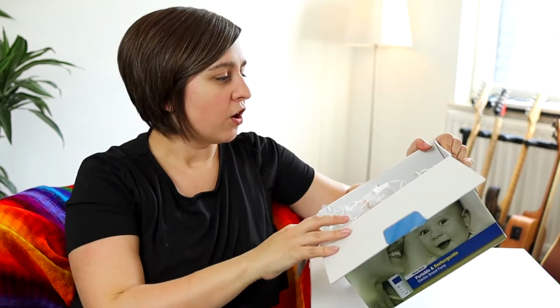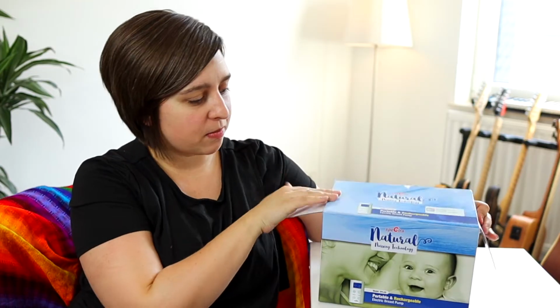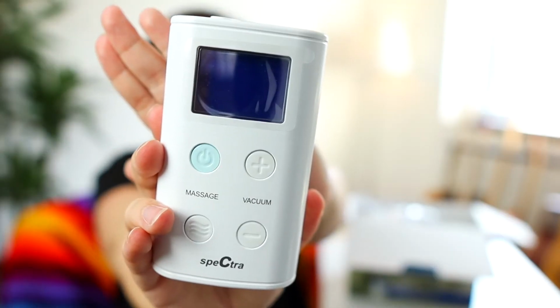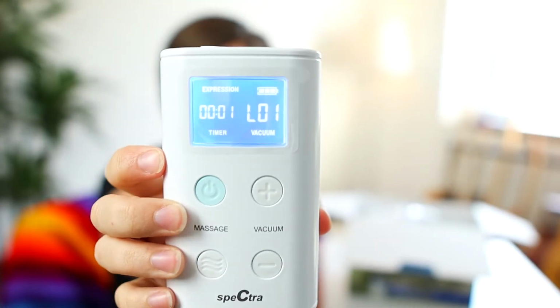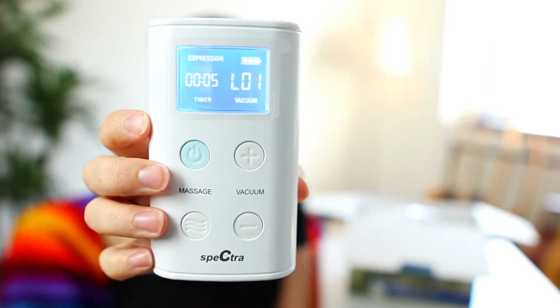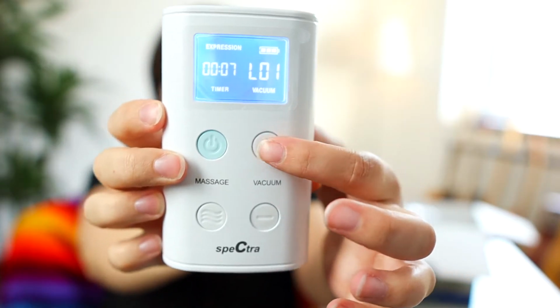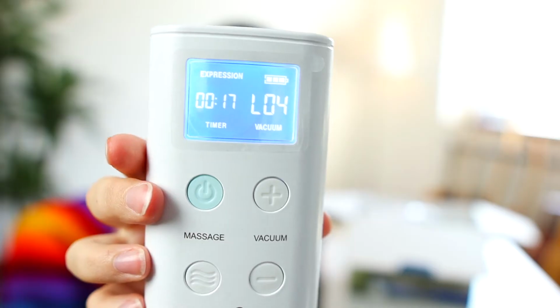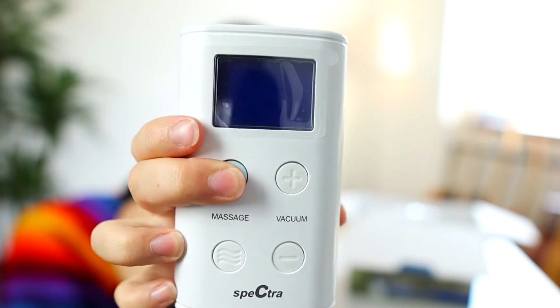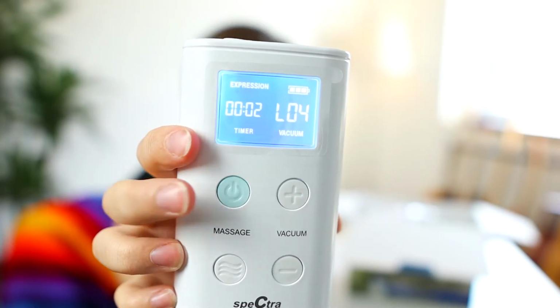Okay, so this Spectra pump. First off, we've got the actual pump. Very small. If you turn this on, it's going to start you off where you left off, I believe, on the suction level. Let's try it. Let's bump it up and then turn it off, and then turn it back on. Yep, it's going to start on wherever you left off on the vacuum level before.